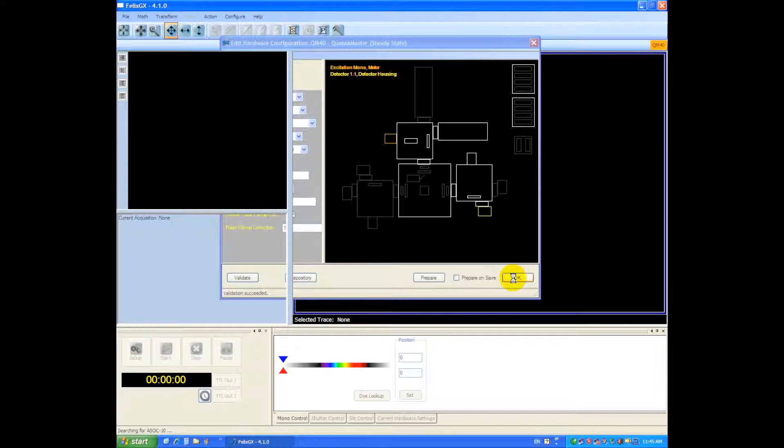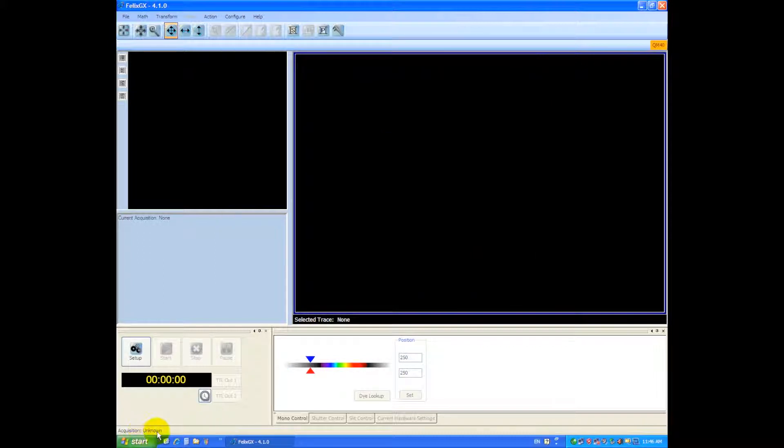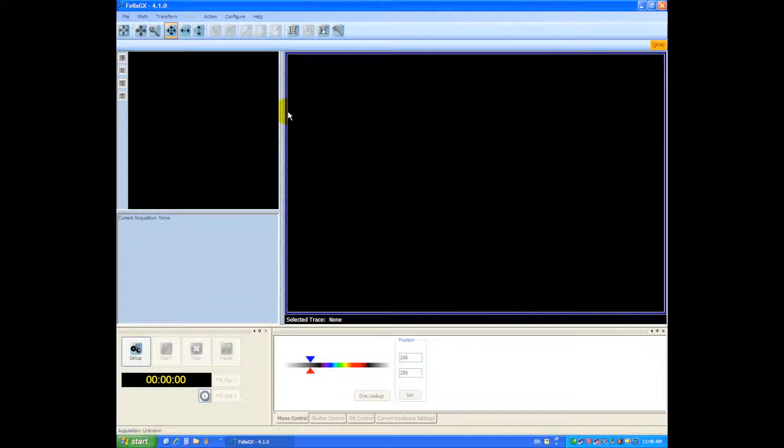So right now the instrument is searching for the IO interface and now the monochromator motors are initializing and now the hardware is configured and you're ready to start your very first experiment.